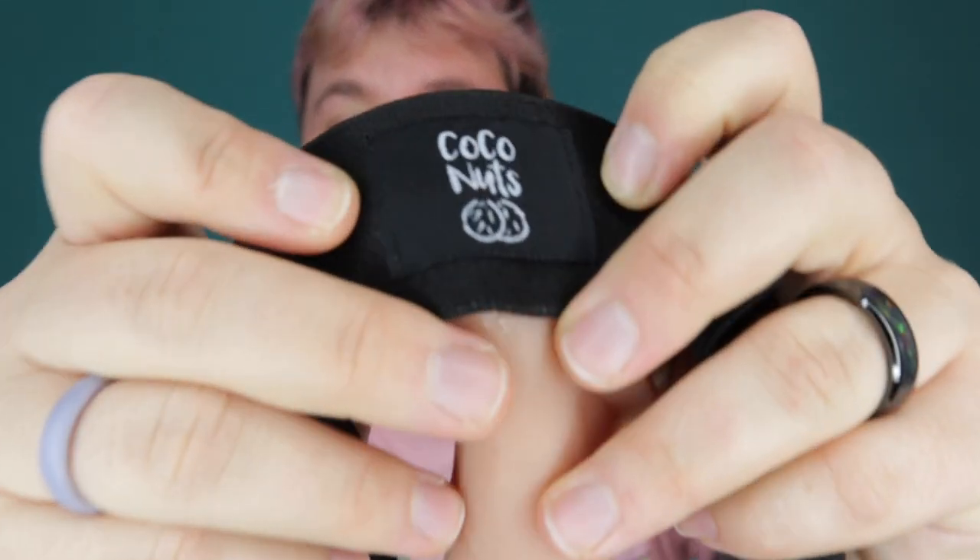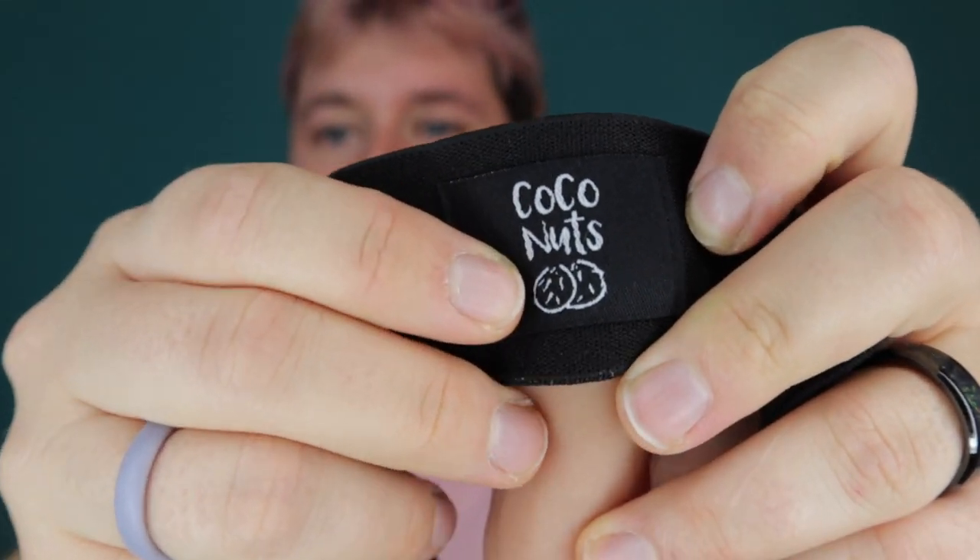I'm telling you this because it has to do with this prosthetic here. Let me show you what this looks like. This is part of their Coco Nuts brand — I love it! And this is what the meta extender looks like. Here is the hole, and this is what it looks like.